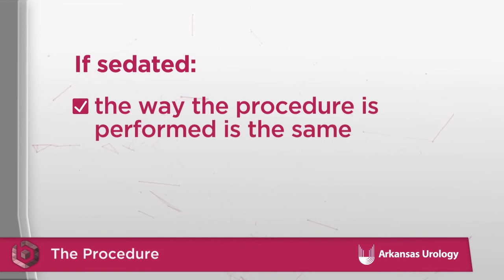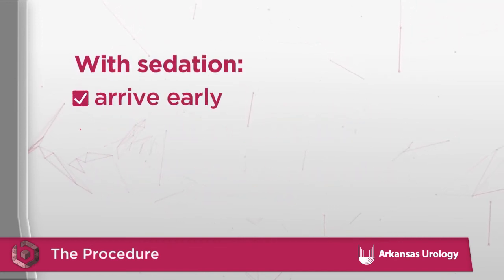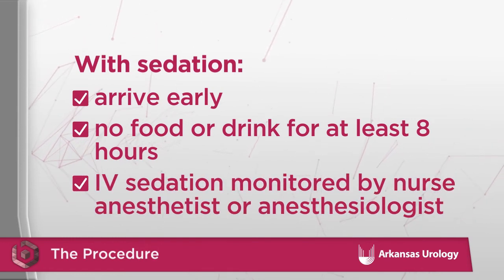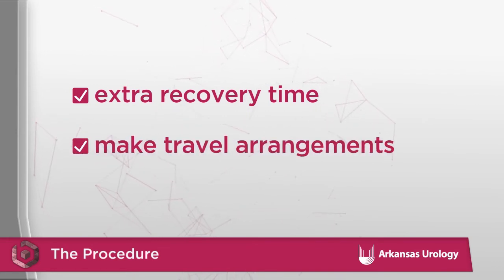If you prefer to be sedated, the way the procedure is performed is exactly the same. The difference is preparing for the procedure. With sedation, you will need to arrive early with no food or drink for at least 8 hours. A nurse will place an IV into your arm to sedate you. Your breathing and other sedation parameters will be monitored by a nurse anesthetist or an anesthesiologist. Since the procedure only takes about 1 to 2 minutes, the anesthesia will wear off rather quickly. Plan to spend extra time in recovery, and you will need to have someone drive you home afterwards.